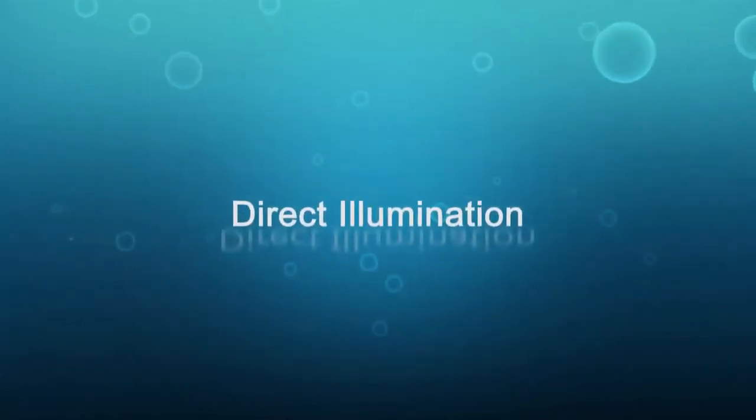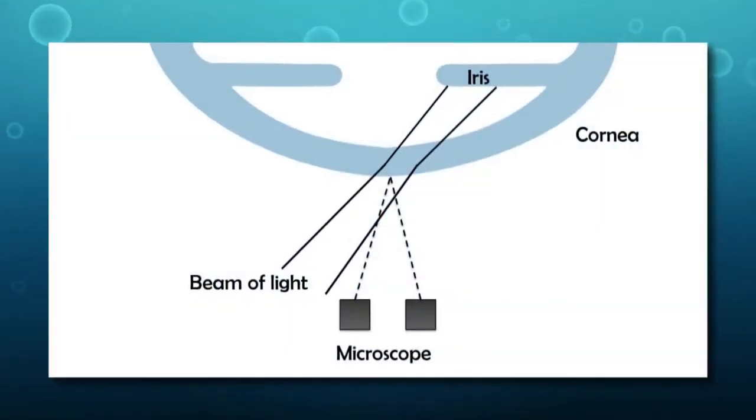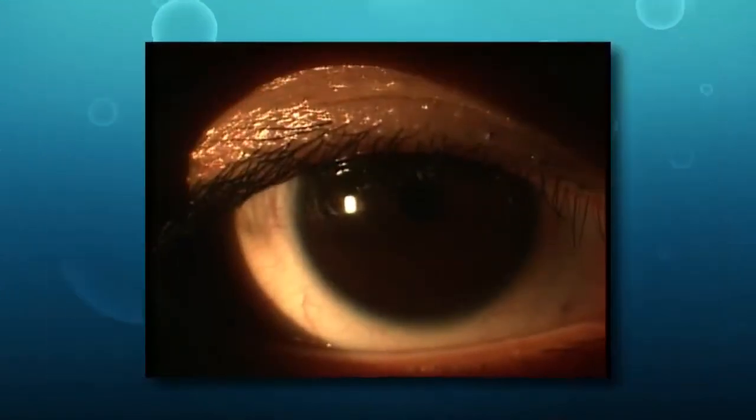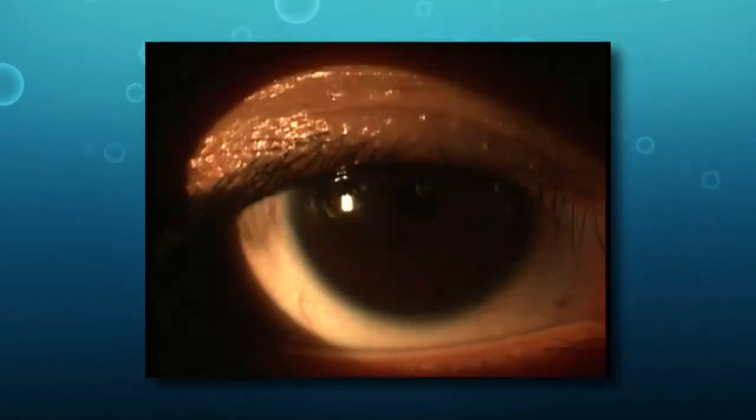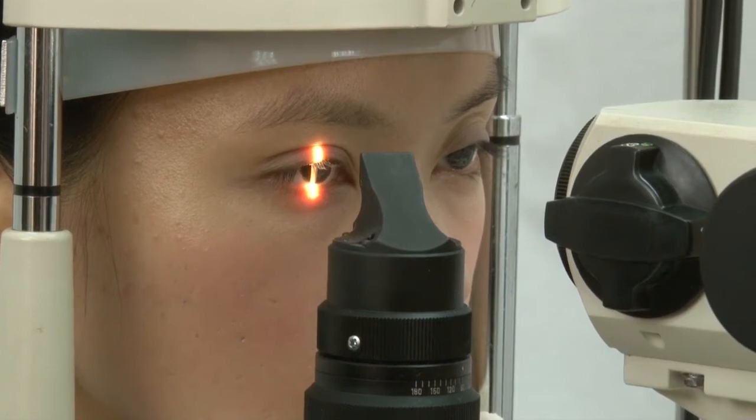The second type is direct illumination. The light source and observation focus coincide on the same spot on the eye regardless of the position of either system. Direct illumination can be subdivided into the following techniques.